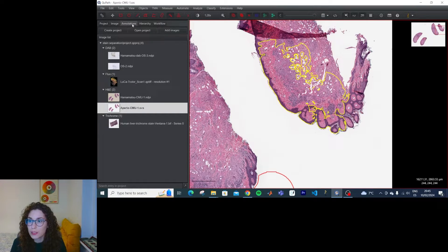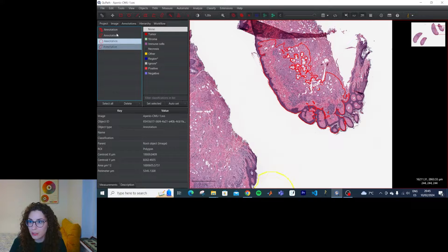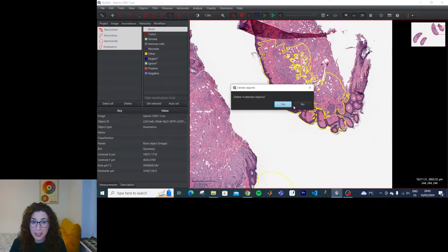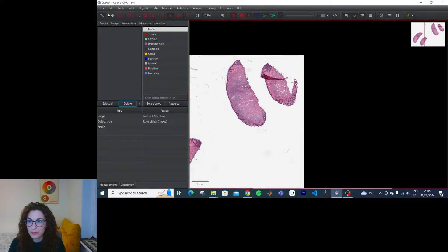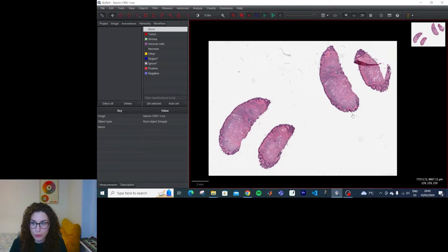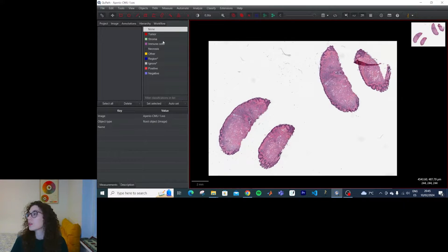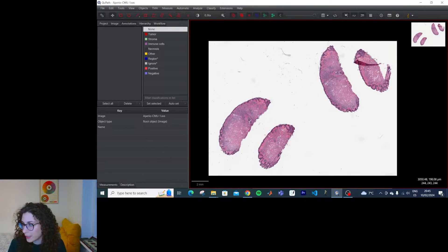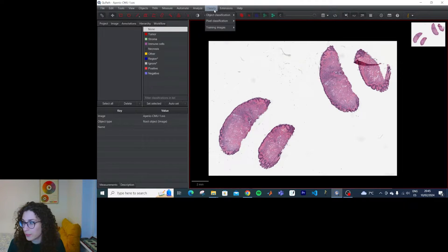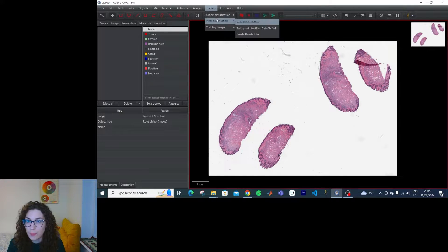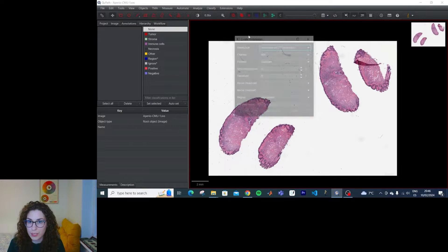So I'm going to delete the annotations, because I don't really want them. And we're going to do this using pixel classification. Okay, so for that we need to do classify, pixel classification, and then create thresholder.